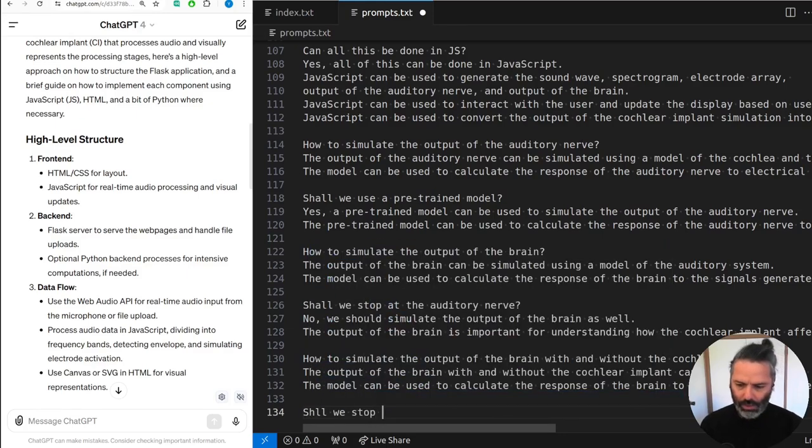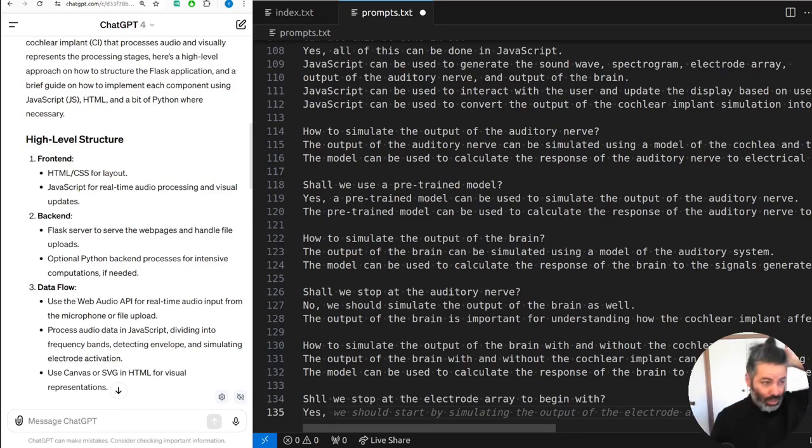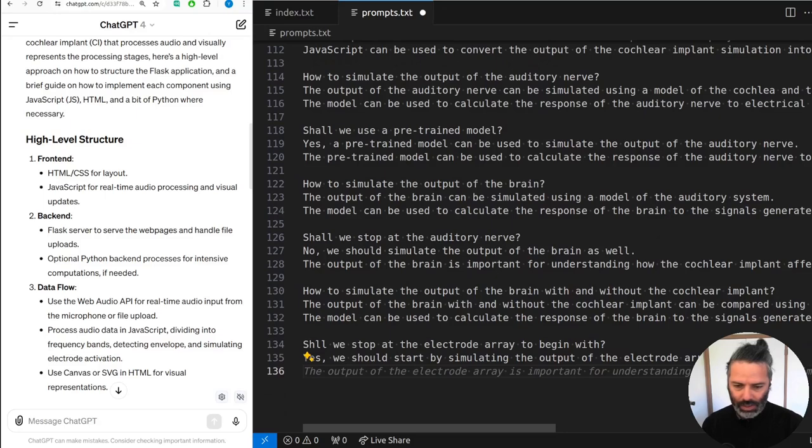Shall we stop at the electrode array, we'll probably say. No, we should simulate the output of the auditory nerve and the brain as well. To begin with, yeah, because we need to start somewhere, right? Still saying no. How about if we change it to yes? We should start simulating the output of the electrode array. Still controlling the board, luckily. It's not getting unplugged and, you know, starting to chop people. The output of the electrode array is important for understanding how the cochlear implant stimulates the auditory nerve. So we might do that at this stage. Okay, let's go.